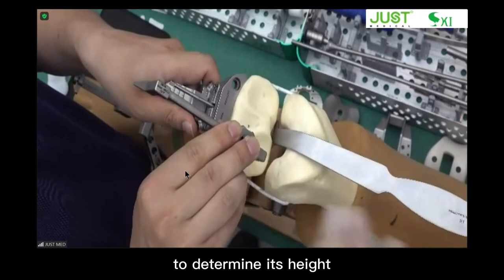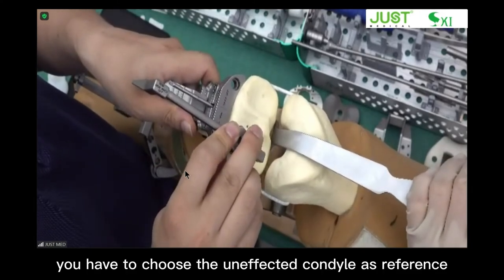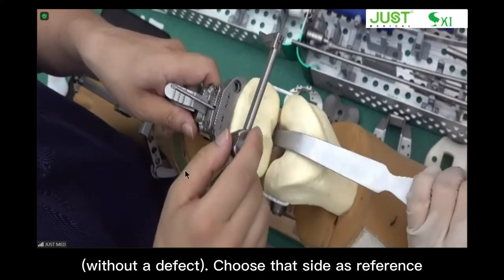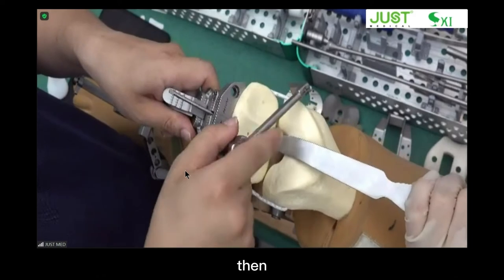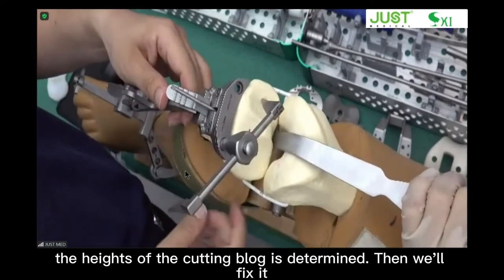To determine its height, of course, you have to choose the unaffected condyle as reference. Without a defect, choose that side as reference. Then the height of the cutting block is determined. Then we fix it.